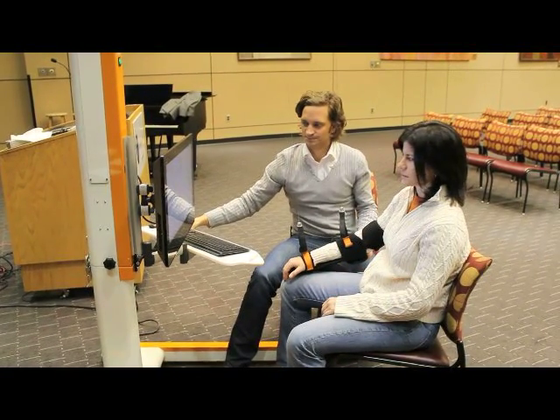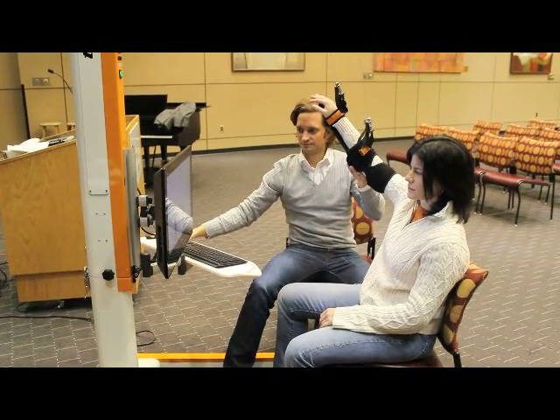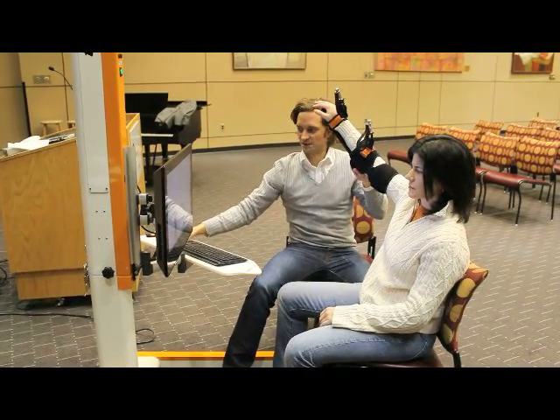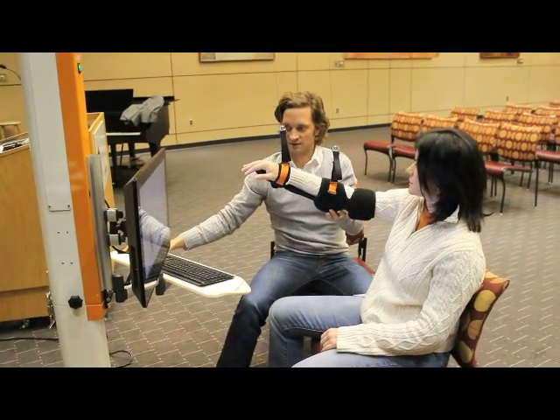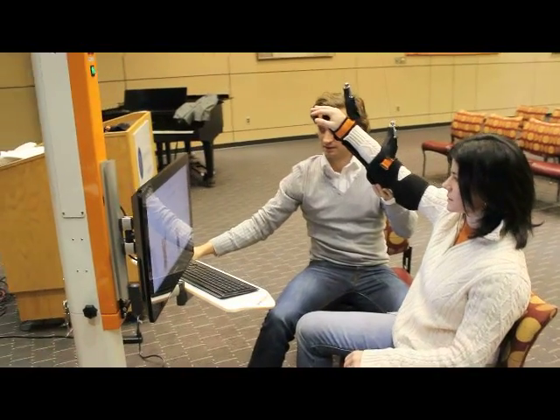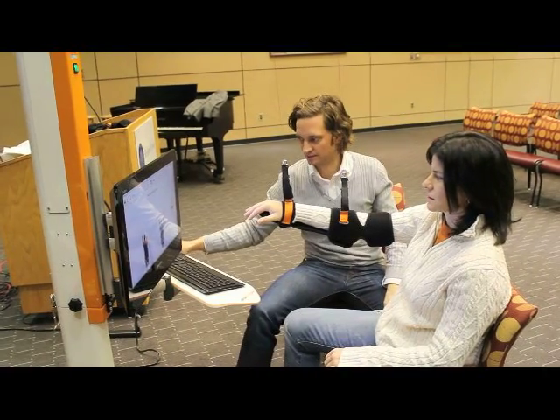Now I'm giving you some weight support. Actually, we are measuring the range of motion. We are setting range of motion first for every patient, so as not to put them in any position that would be uncomfortable or cause pain.